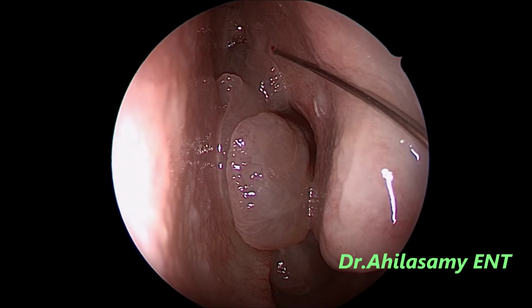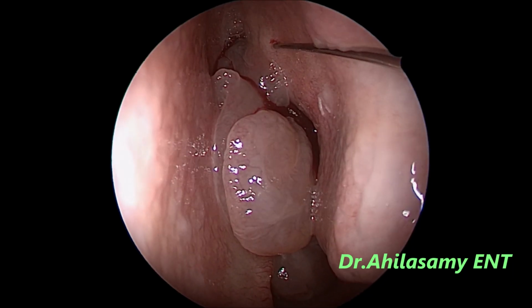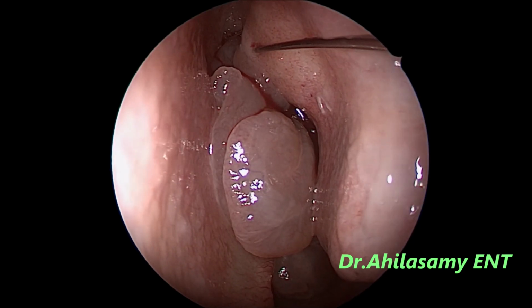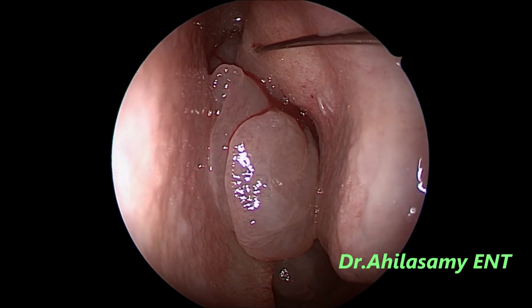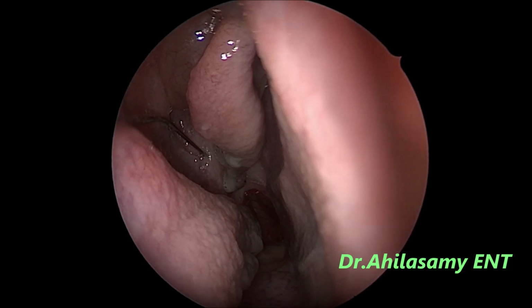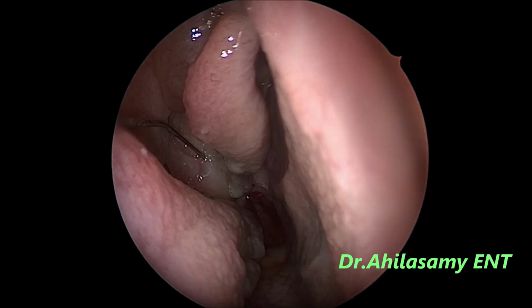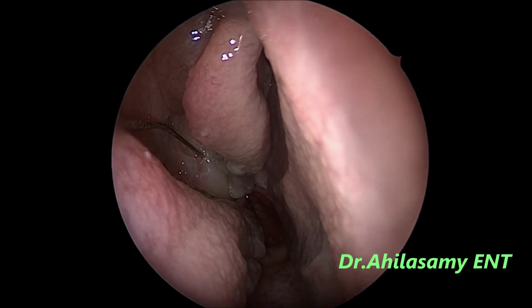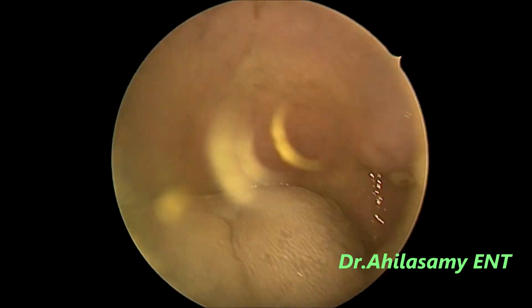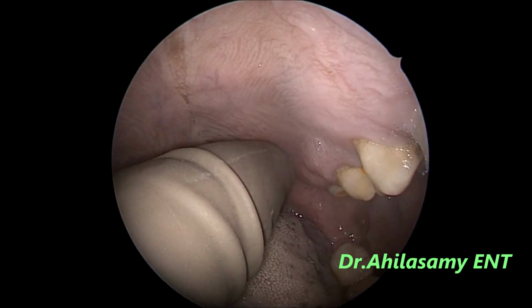Now I am giving the anterior ethmoidal nerve block on the left side. I can't give any more blocks, that is the sphenopalatine block, on the left side because the whole nasal cavity is filled with polyposis. Now I am giving the sphenopalatine block on the right side because I have the space. It is done with a 23 gauge needle with a solution of 0.5% ropivacaine with adrenaline. For 20 ml, I use around 15 drops of adrenaline.